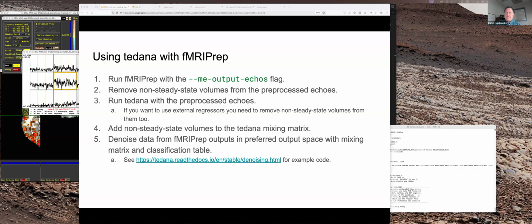I kind of hinted at this earlier. Underlying fMRIPrep does even use some AFNI commands for large parts of this. So it's your decisions for what you do in those earlier steps. fMRIPrep mostly centers on a few options. AFNI gives you a lot more rope to play around with, and also possibly get yourself in trouble.